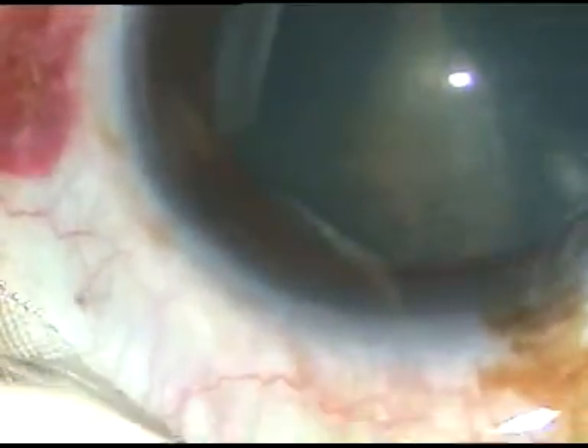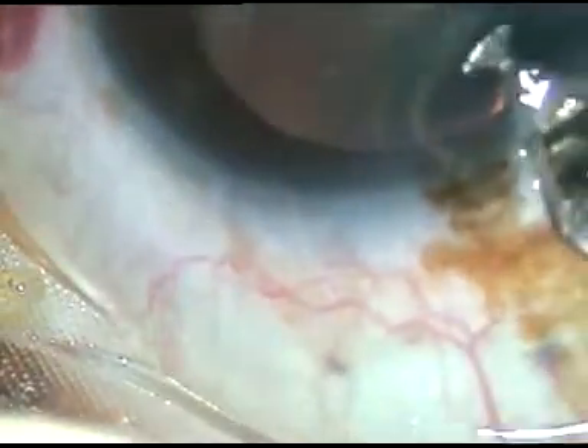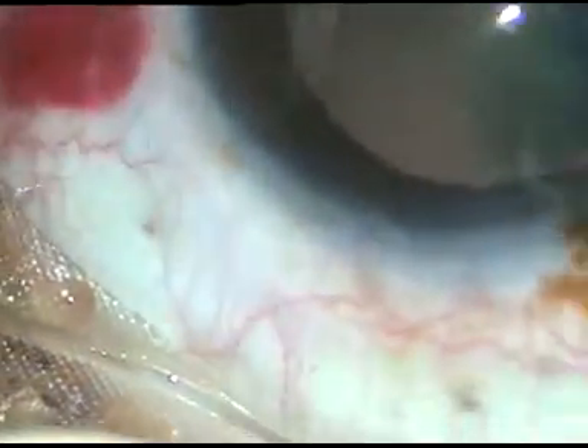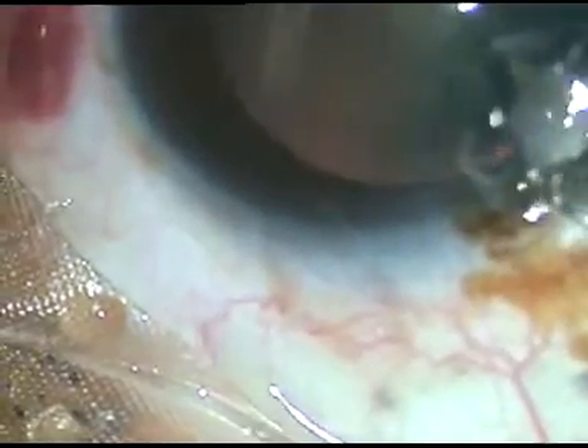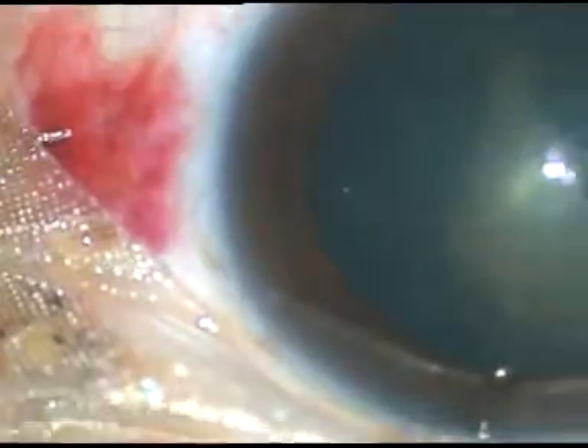Dear colleagues, in some cases the cataract is so soft that the entire lens material can be aspirated without emulsification. This is one such case. You can see there is a very thin layer of posterior subcapsular opacity. The rest of the lens is clear. I have taken up this case for surgery. Let us see how it is being done.